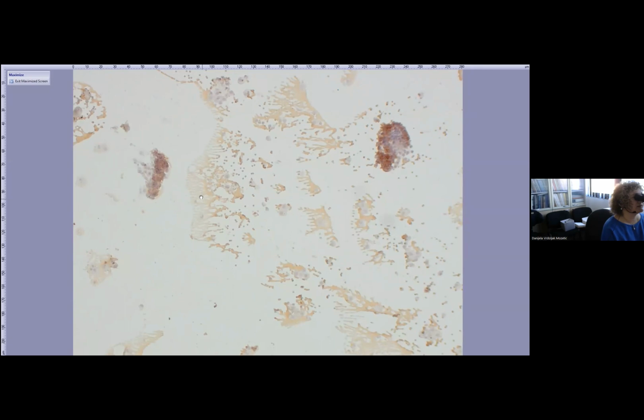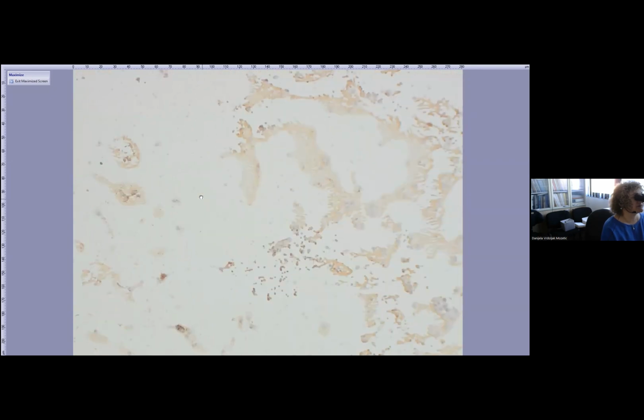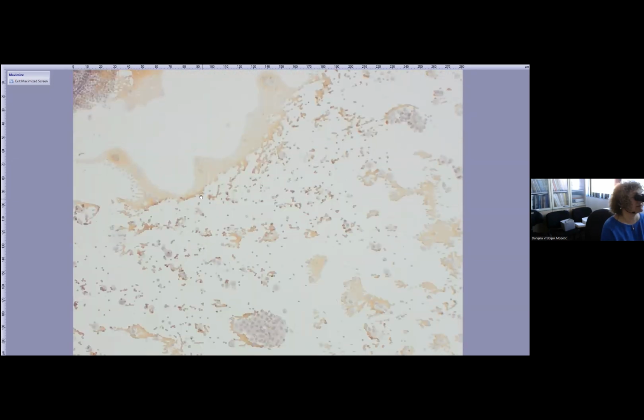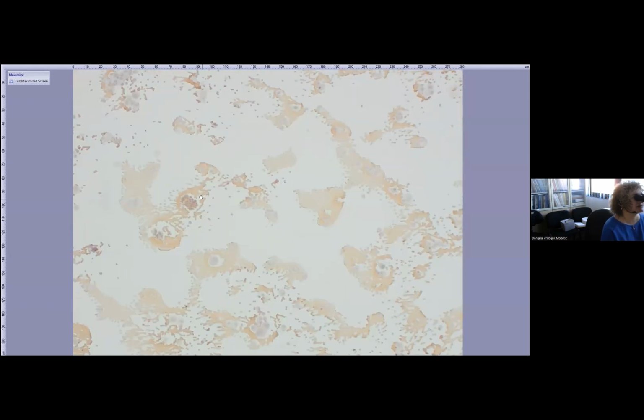So here we had an immuno that was really confusing, but nothing matched anything. So finally we decided, okay, it's negative. Absolutely. So maybe it's a case that is difficult, a bit challenging, but if it doesn't match with anything, you just go with your sense. Absolutely.